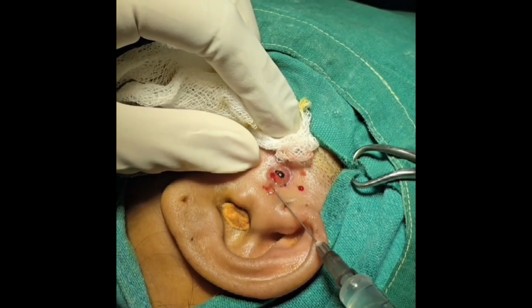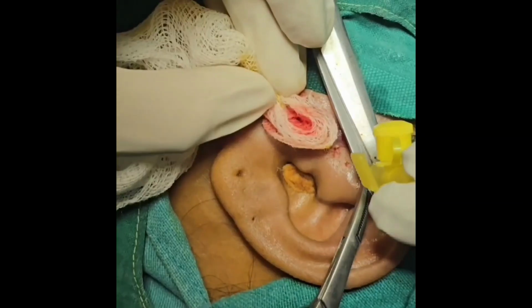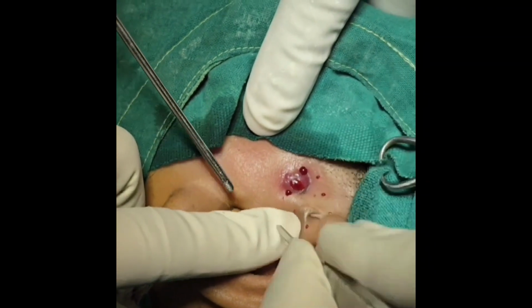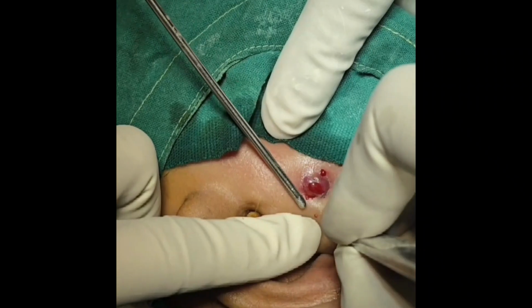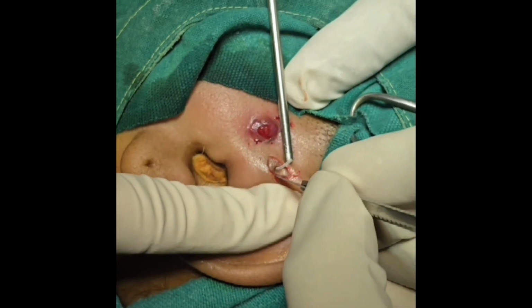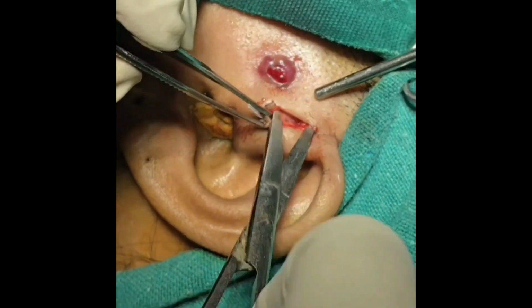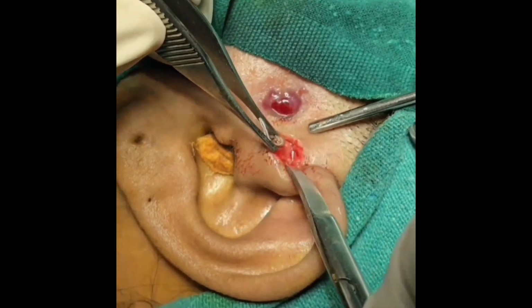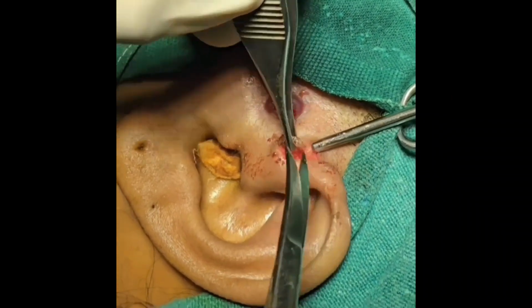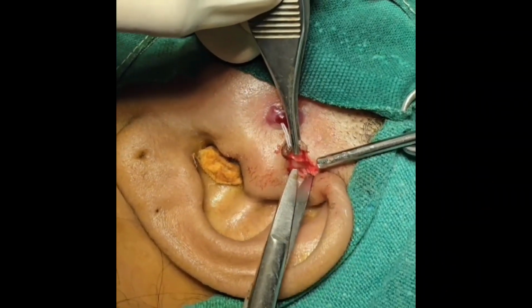She had recurrent abscess. This is the abscess site which is present anteriorly, and the abscess was drained 2 times earlier. So now, starting the excision, first I will try to cannulate and find out the entire tract of the preauricular sinus. I'm using a Neoflon 24 gauge to identify the tract, and then by an elliptoid incision around the tract I begin my dissection. So the incision has to be given superficially, otherwise it will cut the tract.